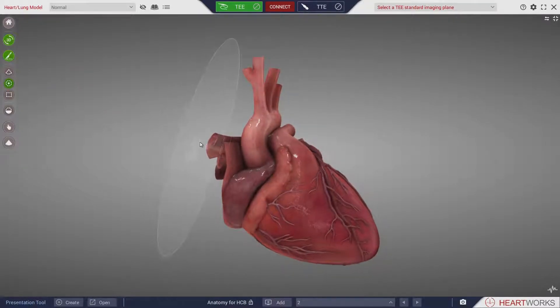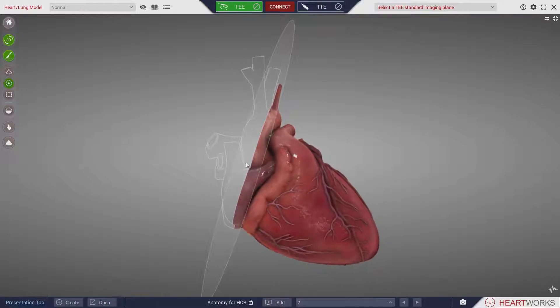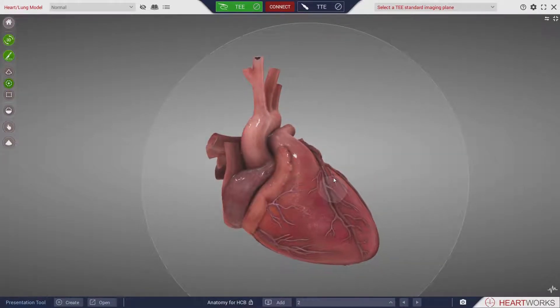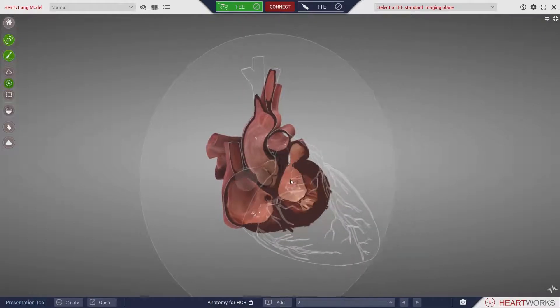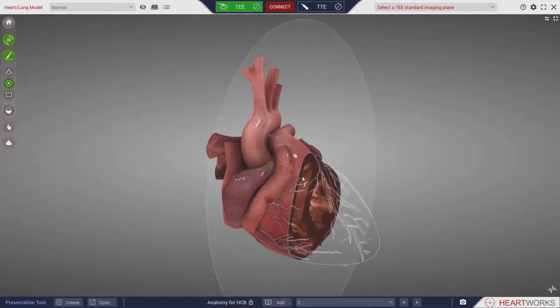The interior structures of the heart can be visualized by using the SLICE controls. These controls allow detailed examination of the interior cardiac anatomy.